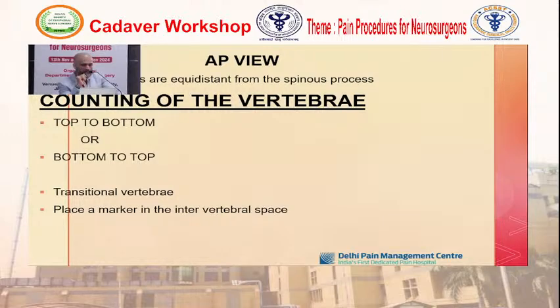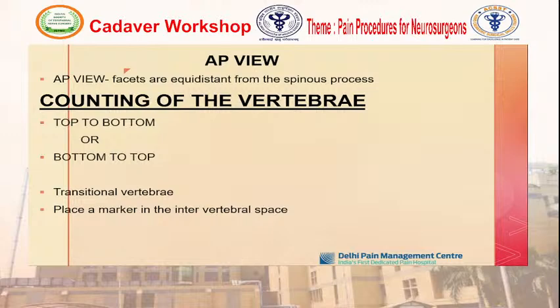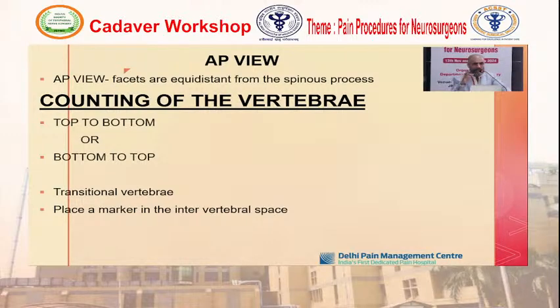That is one. How should we count the vertebrae? Top to bottom, bottom to top? Anybody? Doing both would give a lot of radiation, sir. Huh? Agree, disagree? Exactly. So it is top to bottom because you come from a neurosurgery background.